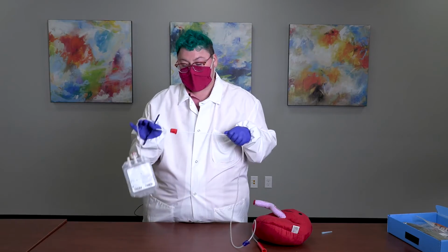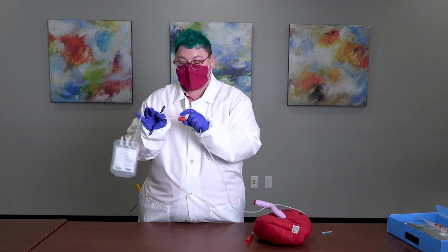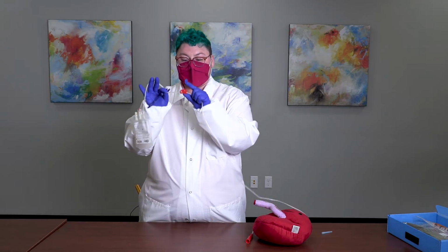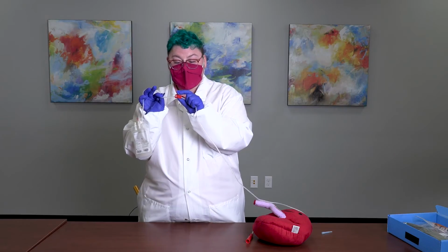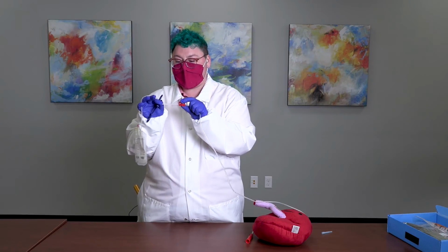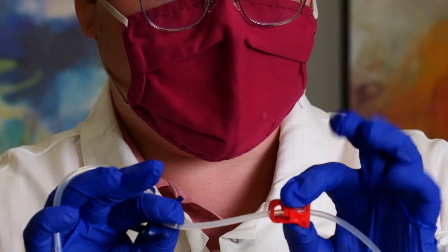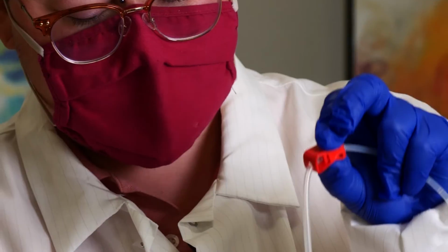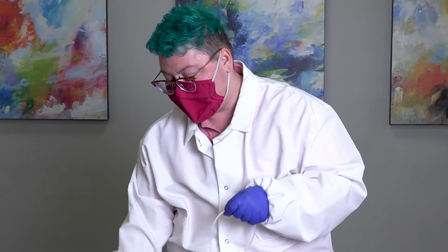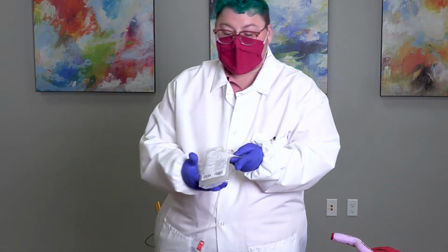After stripping the tubing has been completed, we'll go ahead and permanently clamp this. This red clamp is a permanent closure, and once clipped, cannot be unclipped. So you go ahead and close that, and that will prevent the blood from getting out. Once that's been completed, the tubing line can be cut off, and the needle and tubing can be discarded in a sharps container. At this point, you'll want to go ahead and label this bag.